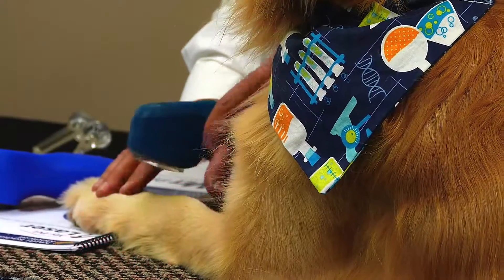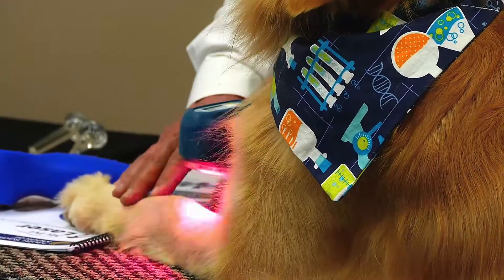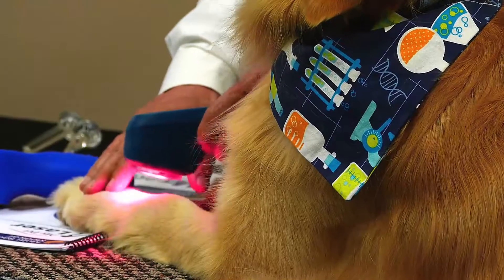With wounds, low and slow is best and less is more. You don't want to over-stimulate a wound. You just want to keep those tissues stimulated to make more ATP, to give you new healthy cells to proliferate to the site and make it heal faster.